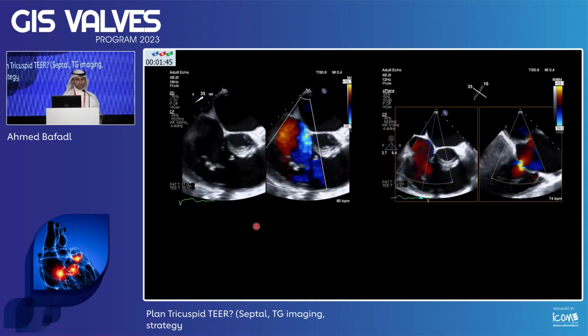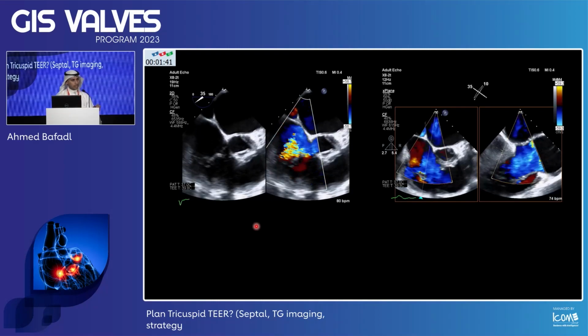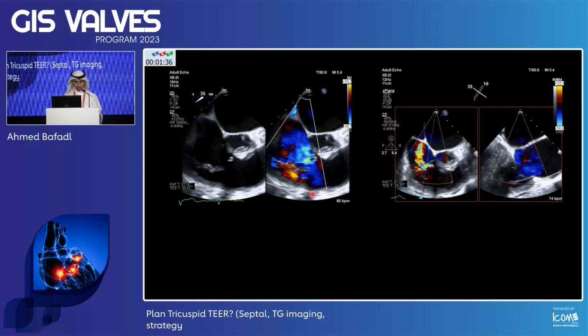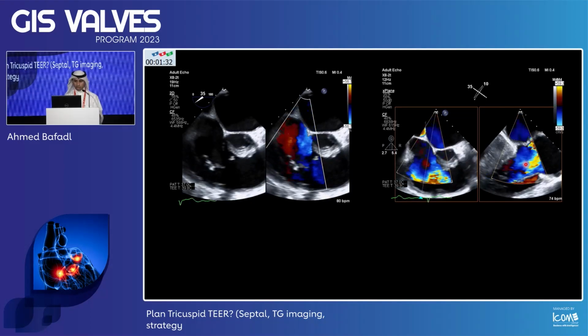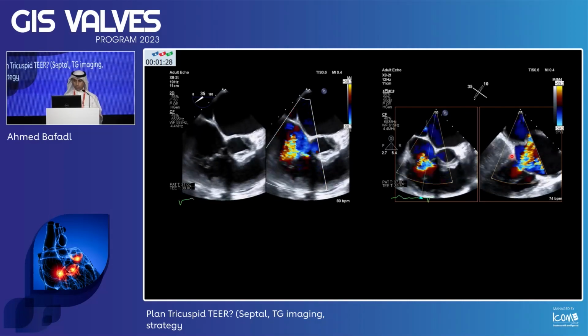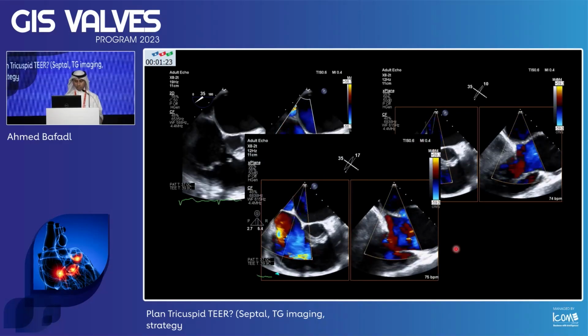Here we analyze the color. Analyzing the color in this view is very helpful. Likewise in the mitral, this is the commissural view of the tricuspid valve. Then you see how wide the jet is. So here you analyze again your jet and your leaflet length. If you have the color compare option in your machine, then you go all along the side of the leaflet.